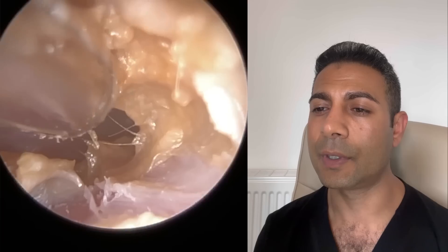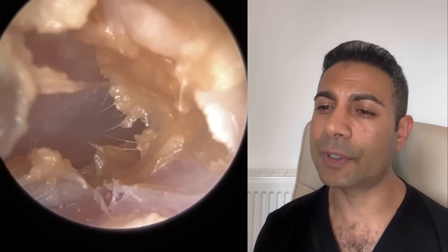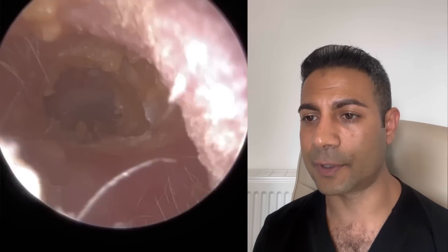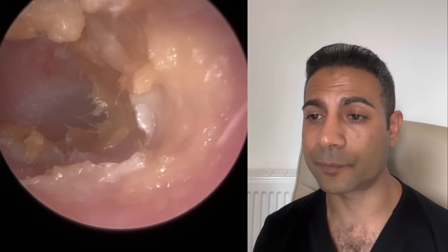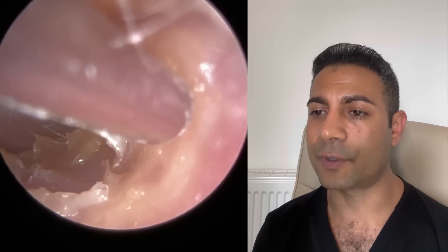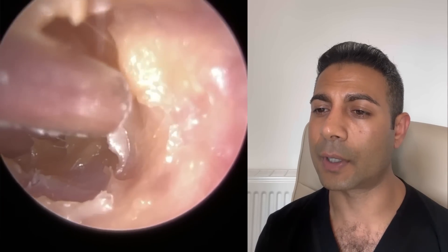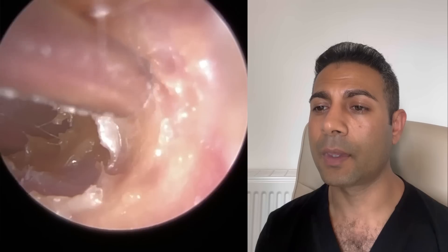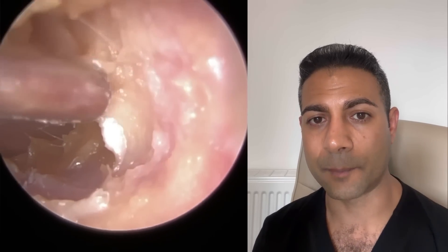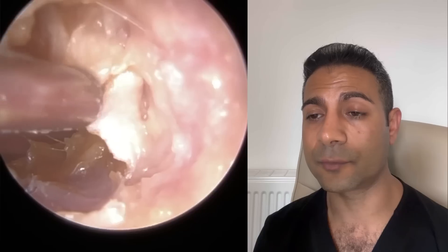What I'm going to try and do is remove as much debris as possible. Not only will that hopefully help the patient's itchiness and irritation, but when they are subsequently prescribed any medication by their GP, it's going to allow the medication to really penetrate against the canal wall itself and better fight away any harmful bacteria causing this bacterial infection. I'm using the standard zolnir suction probe at the moment, but I'm going to revert to the fine end suction probe, which is of a smaller diameter.